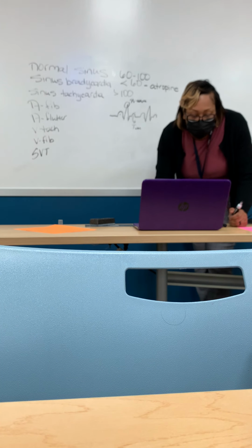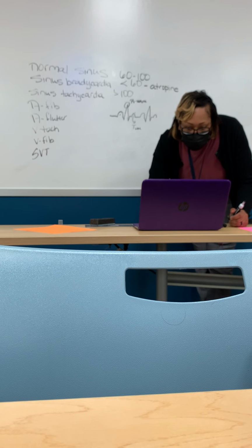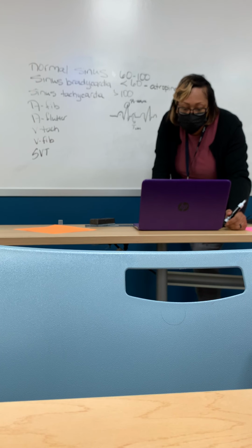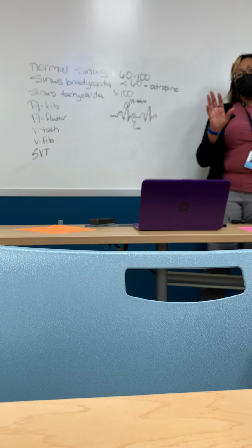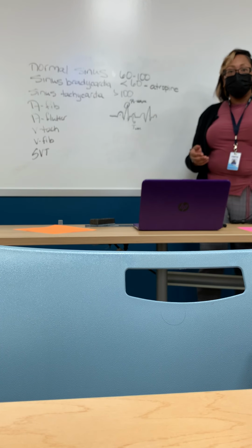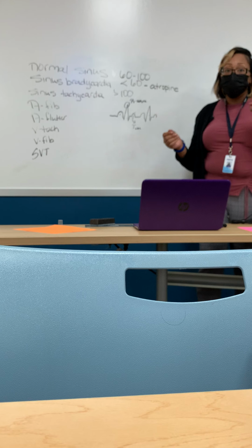Sinus tach. Look at slide number 16, or is it 17? Can you find the P in front of that QRS? Your T is huge, but you see there's a P right in front. Count the P's. I thought we count the R's to get the heart rate. You can count the P's or the R's, it doesn't matter when they're both normal. The P is your atrial contracting, the R is your ventricle, and they usually contract at the same time normally, until we get here.